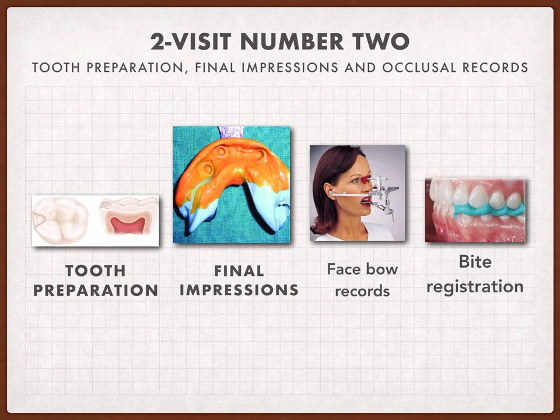In this visit, we will do the tooth preparation, as we can see in the left picture, as we have designed on the primary casts.